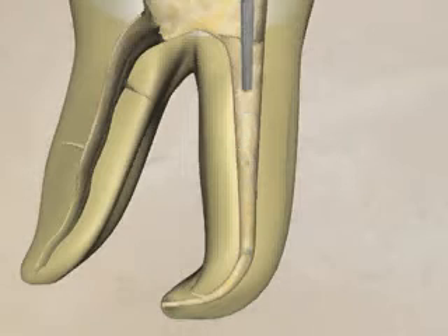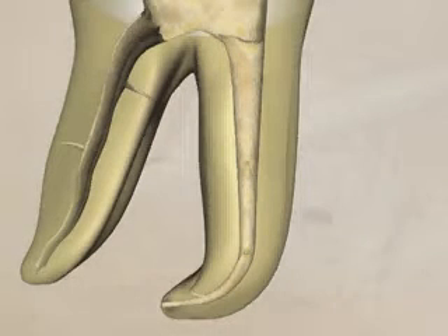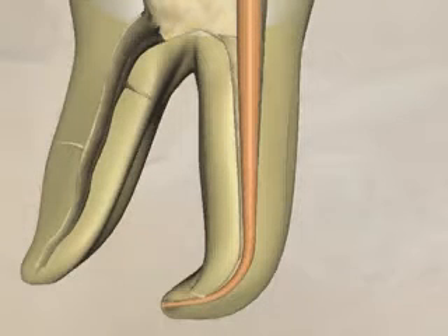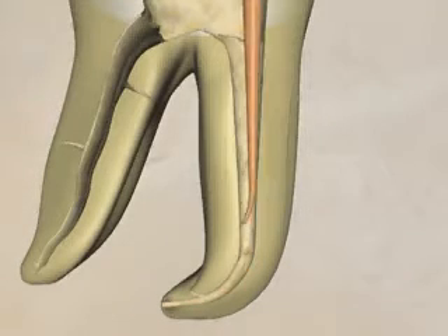A gutta-percha cone is selected to closely match the canal space. The cone is inserted to length. The appropriate cone should bind slightly at the apex and exhibit a slight tug back when removed.